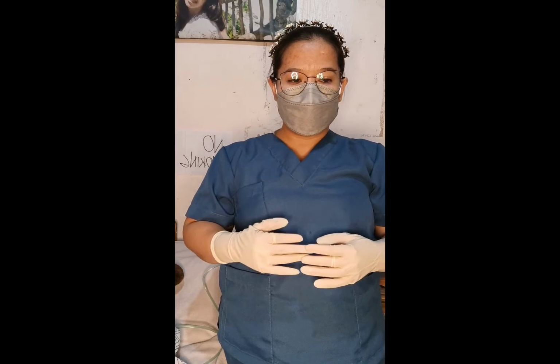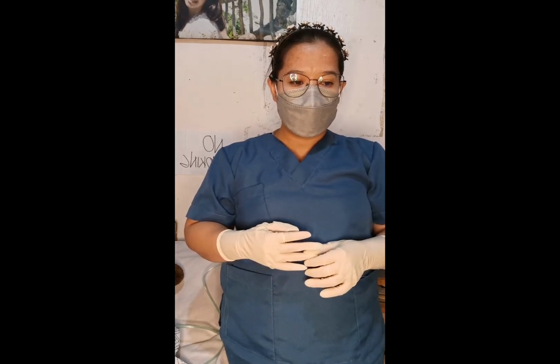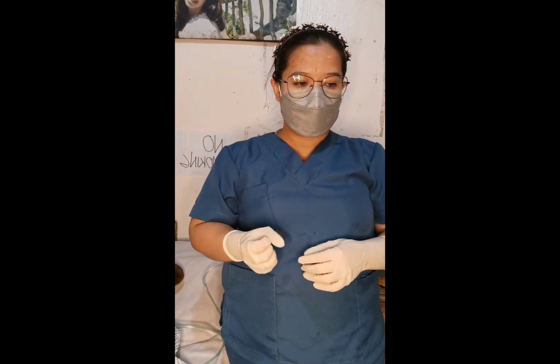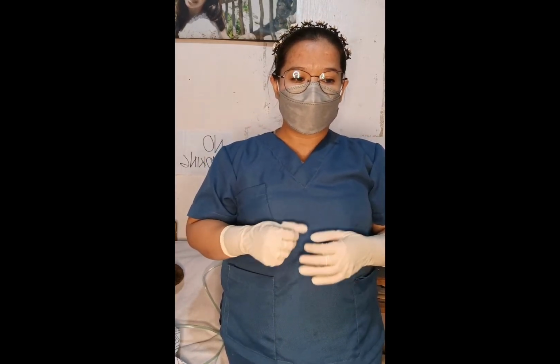Oxygen is a drug, and administering using the 5 rights avoids potential error, and teaching helps ensure compliance with the therapy.